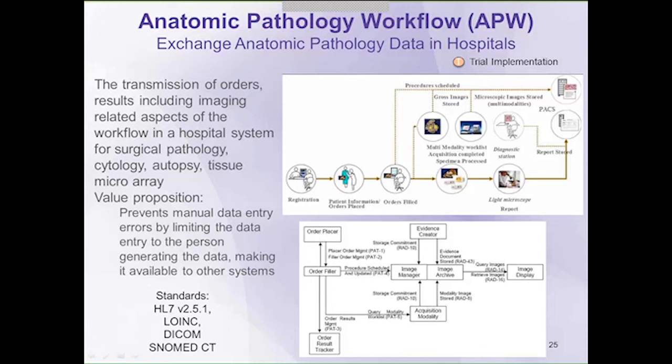However, we need to start thinking about the old workflow and the new workflow. Obviously, the new workflow, utilizing digital images, has an opportunity for automation, has an opportunity for interaction of vended systems in a way that facilitates activities that enhance patient care, enhance productivity, that simply would not be possible before, and understanding exactly what needs to be machine understandable and what needs to be human readable and communicated through these various platforms is very important. So next slide.